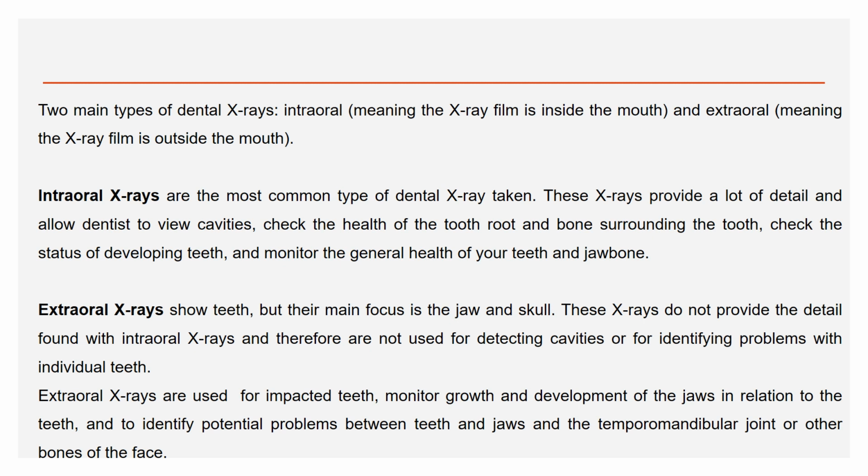So basically, intraoral radiographs are much more commonly used to detect caries and their prognosis. Basically, you look into the periodontium, the tooth and the attachment, so then you can decide the treatment plan, whereas extraoral is more towards the growth of the bone, or if there is any big lesion or multiple lesions around the tooth. In those conditions you can use the extraoral radiographs.